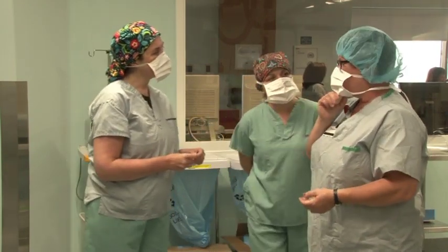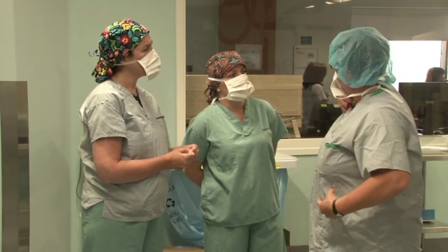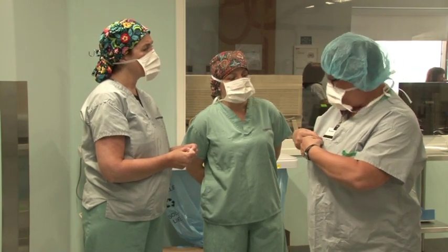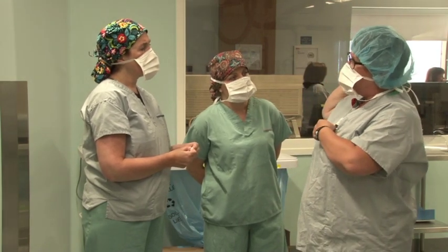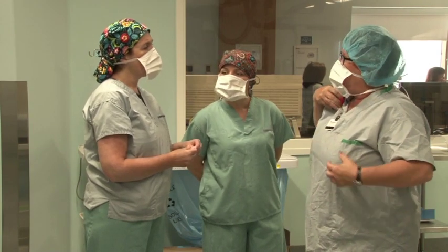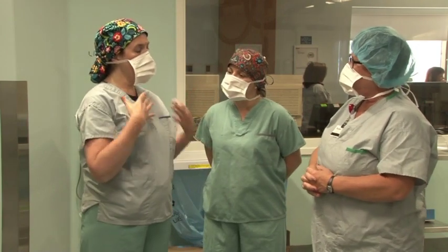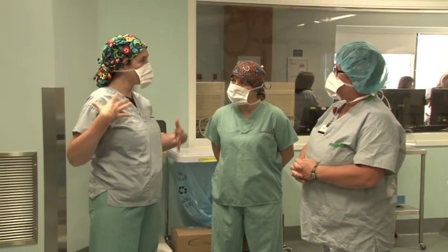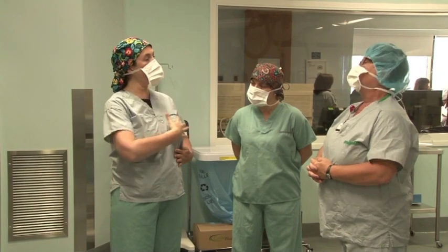Which reminds me, I know in orientation they talked about putting those quick combo pads on. Yes. I can't remember if they wanted the wire to come out the bottom or the top. You know how the two pads are joined together? Yes. Does that get in the way? For this procedure, we just want to make sure when we put the hands-free on, and it depends on a patient's size, we usually have the wires going in this direction. We don't want anything over this area.